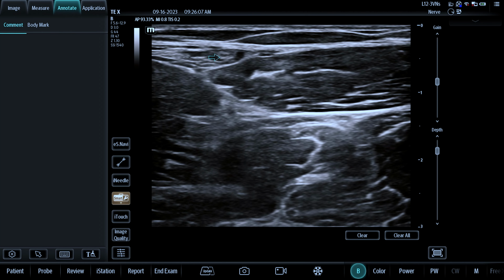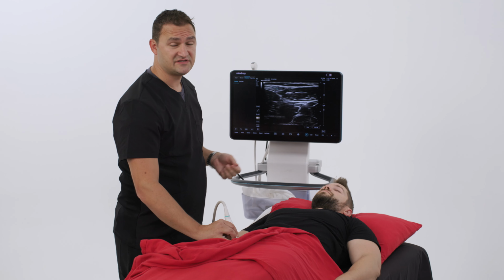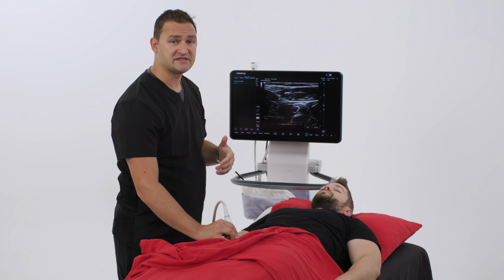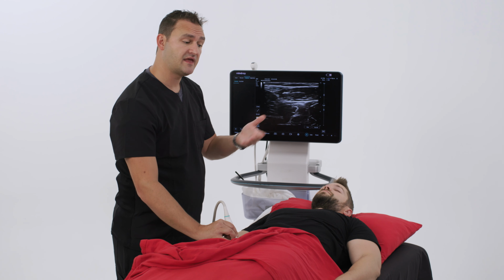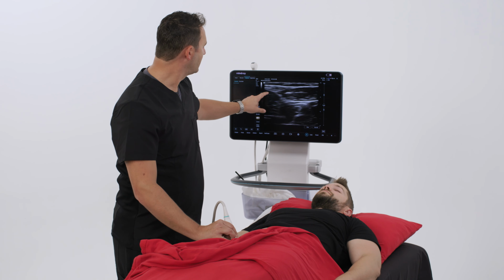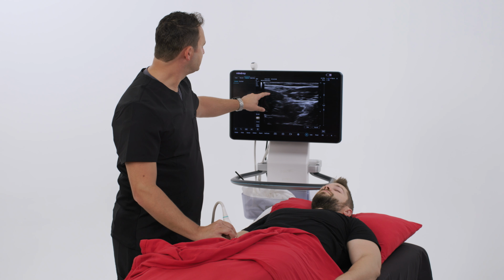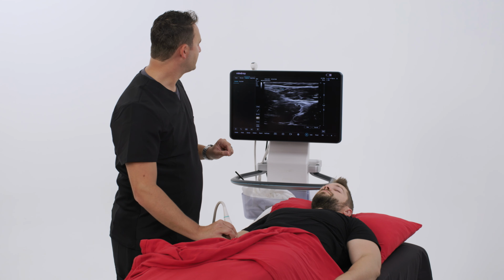And you don't need a lot of local anesthetic for this. This is going to be 2 to 5 cc's of local anesthetic. As I mentioned earlier, when I do hip arthroplasties, I'll generally put 25 cc's for my PENG block, and I'll put the other 5 cc's for this to do the lateral femorocutaneous nerve block. And then it's just right here, right where the sartorius meets the tensor fasciae lata muscle. Right above it is where you'll see that nice lateral femorocutaneous nerve.